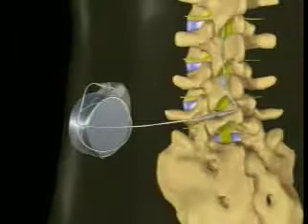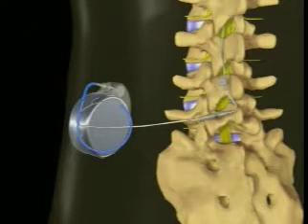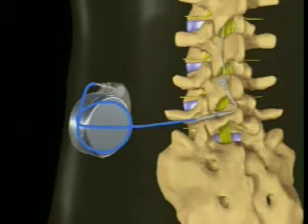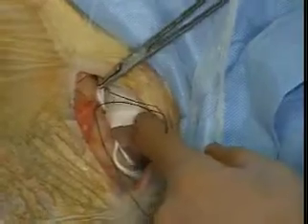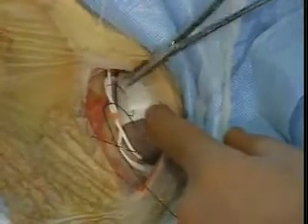The system should be arranged so that no sharp bends are present for the entire length of the catheter from the pump connector port to the spinal anchoring site. To avoid excessive pump movement, be certain to suture the pump to the fascia within the pocket in at least 3 places around the pump circumference. Incorporating these surgical techniques can reduce catheter kinks and occlusions, both at the spinal anchoring site and at the pump pocket.